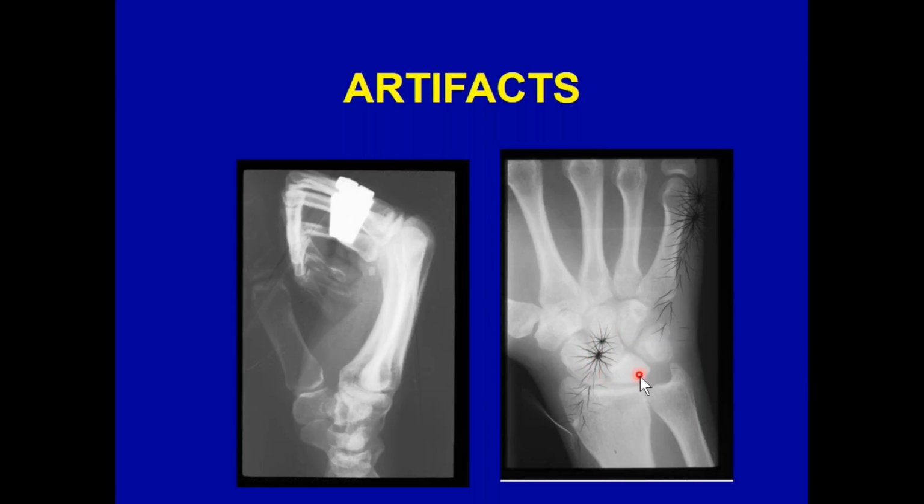If the doctor can't tell whether there's a problem there, the X-ray has to be done again, but you would have to be astute enough and clever enough, and I know you are, not to pull the film out as quickly as you did the previous time. But the most likely scenario is you're not the only one taking X-rays. The patient comes in when it's somebody else's turn on Thursday. They don't understand the importance of it because you didn't tell them, or it's not common knowledge. They pull the film out.